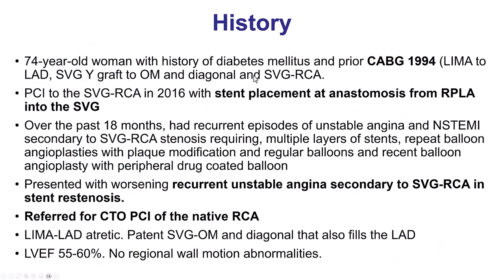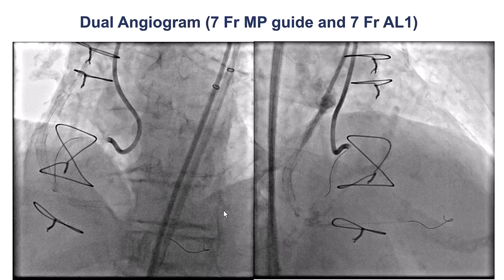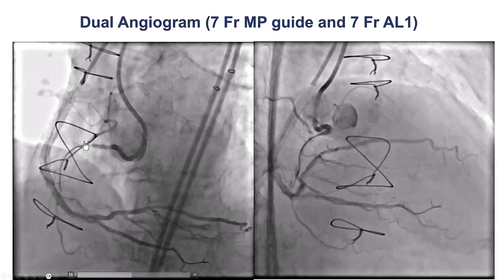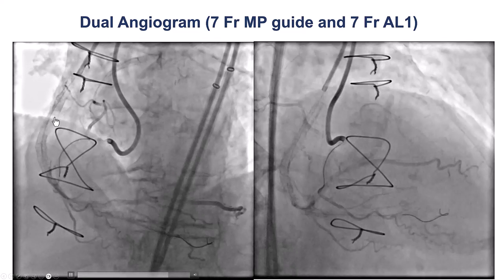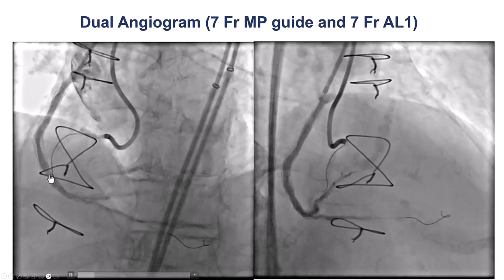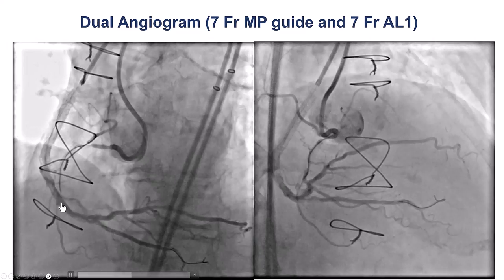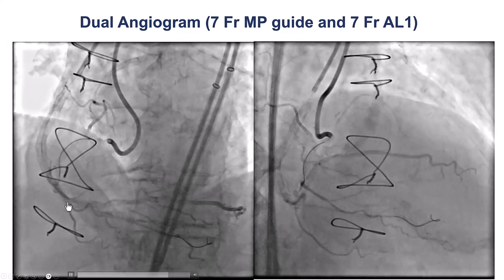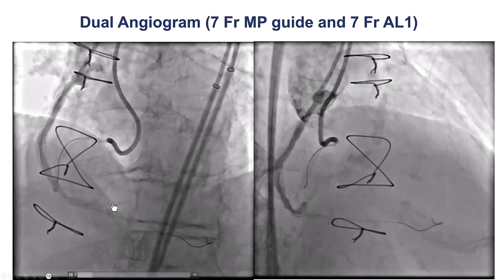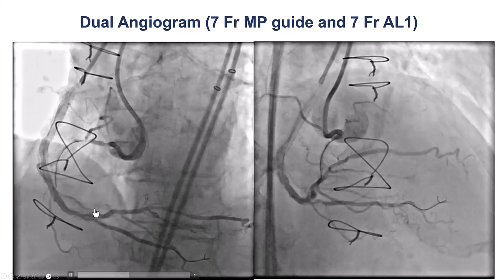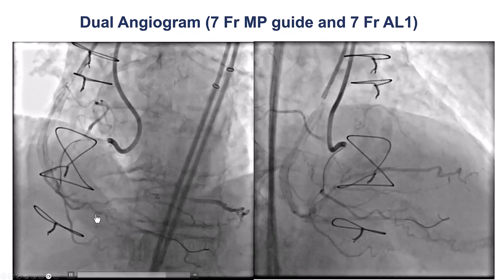The patient was a gentleman who had previous coronary bypass graft surgery, and then he had failure of the saphenous vein graft to the right coronary artery — multiple episodes of failure — and he was sent for recanalizing the native right coronary artery CTO. This is the diagnostic angiogram showing the failing bypass graft with multiple stents. Unfortunately, there is actually a stent going from the bypass graft into the native coronary artery, and this was the source of a lot of challenges as we will show during the case.